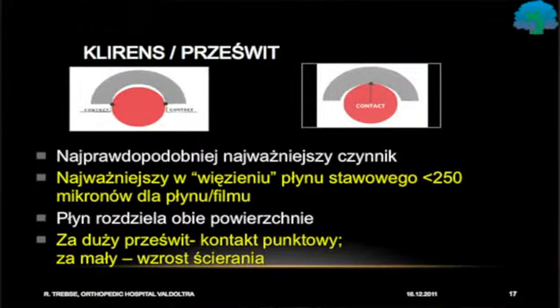Clearance is one of the most important issues in tribology. Clearance is actually the difference between the diameter of the head and the inner diameter of the socket. If you remember the equation, the lower the clearance, the better the lubrication regime. But on the other side, if clearance is too narrow, sudden clamping can occur, a sudden increase in frictional torque because of slight deformation of the socket.